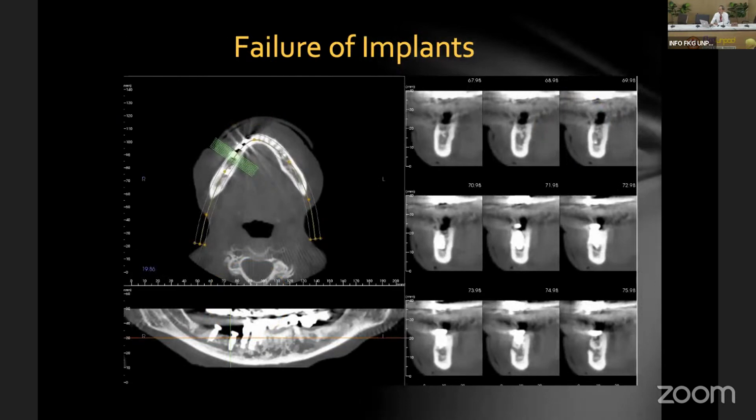Now, this is another failure of dental implants. She is an unfortunate patient who had implants placed outside. The dentist also used panoramic only to place the implants. Sometimes the panoramic radiograph cannot show the mandibular nerve canal well. So this one turned out to have perforation of the mandibular canal. That's the reason the patient got permanent numbness of the lip.